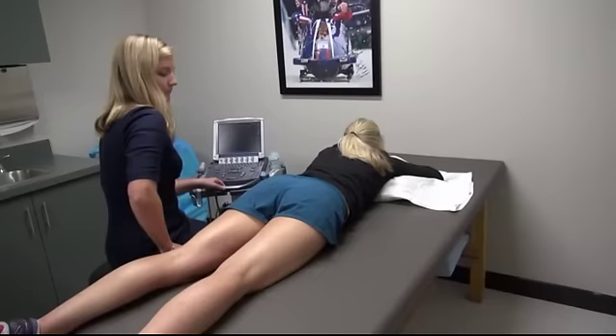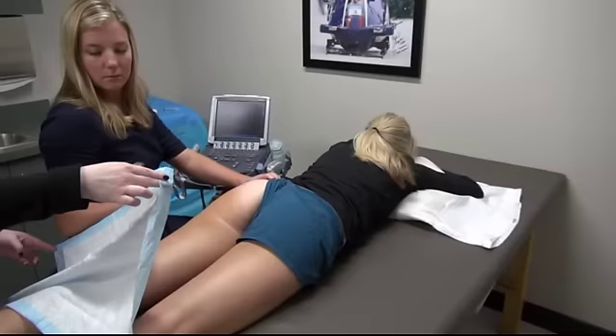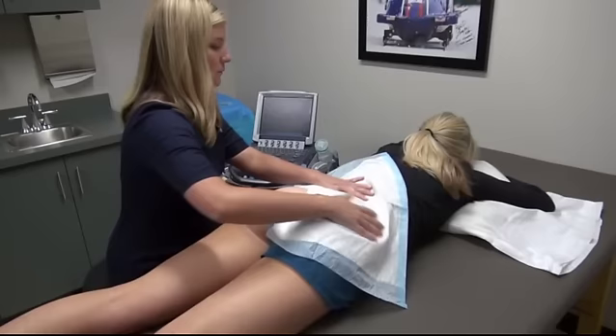During the procedure, a patient is in the prone position with a lower extremity in neutral rotation. The patient is asked to move to the edge of the table and the buttock is draped with aseptic towels or a medical pad. The ultrasound machine is placed on the symptomatic side of the patient and positioned in front of the provider.